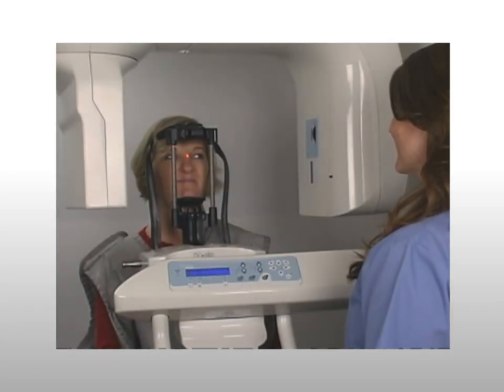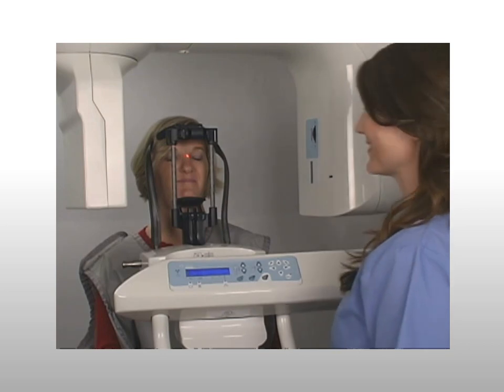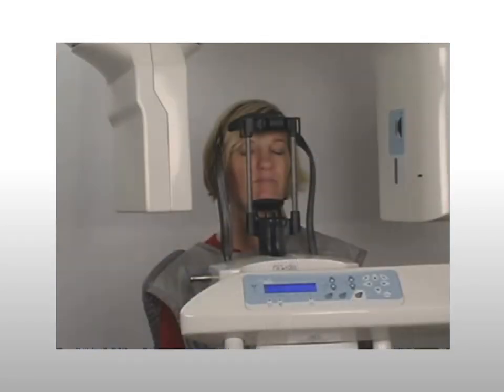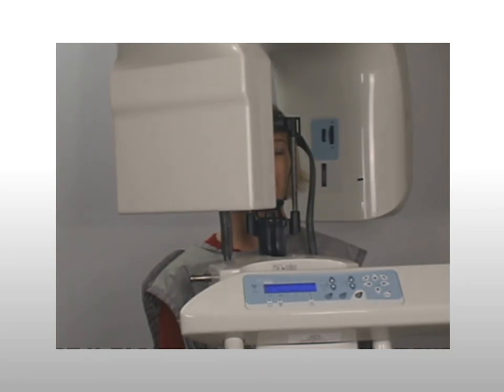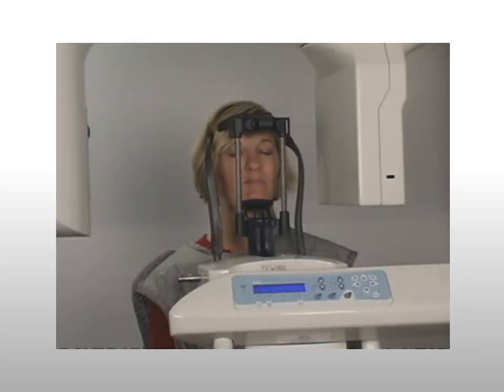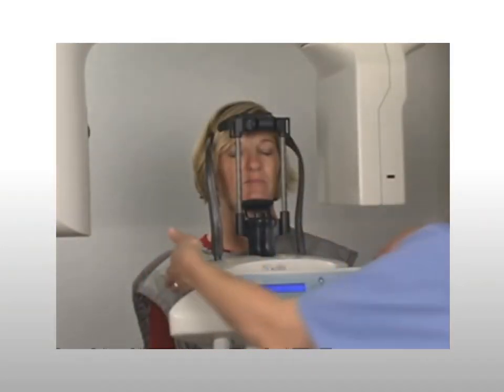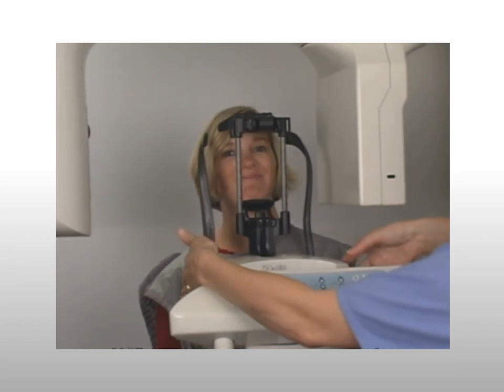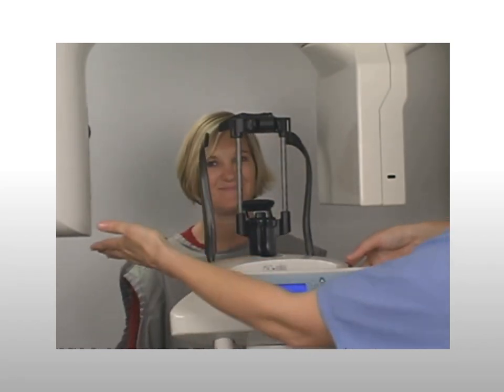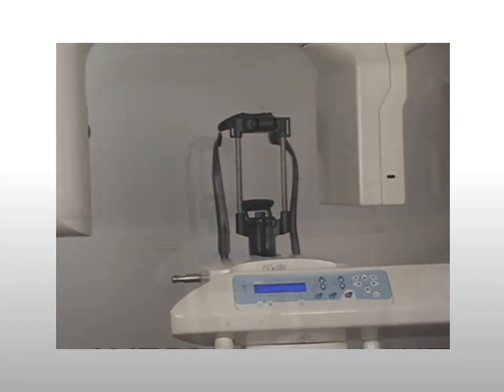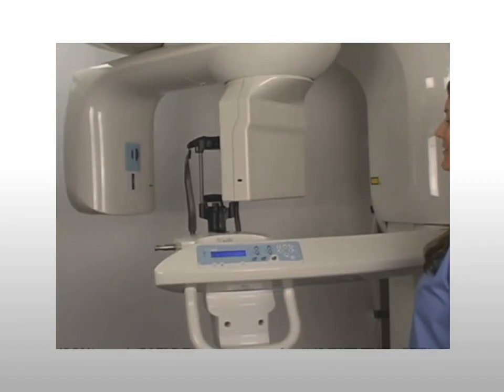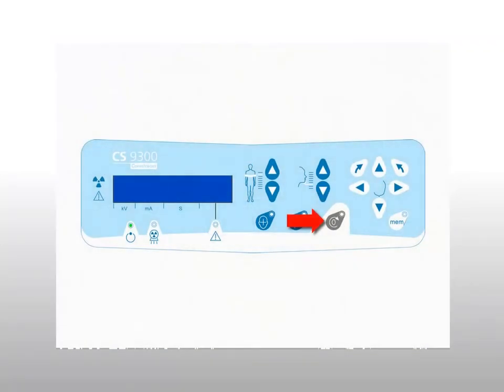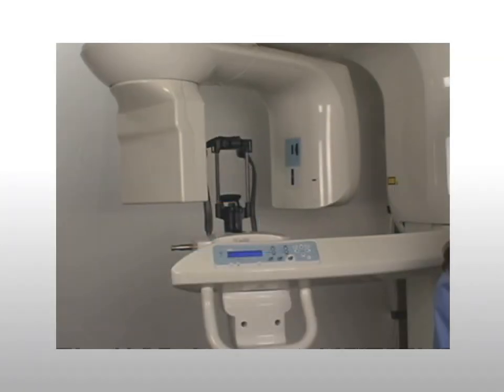Instruct the patient to breathe through the nose and remain still. Exit the room and acquire the image. After the acquisition is complete, return to the room, open the temple supports, and assist the patient in exiting the machine. To ensure the machine is ready for the next patient, press the reset button on the control panel — this returns the unit to the home position.